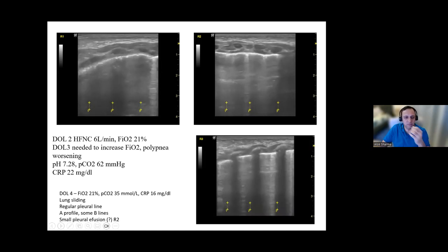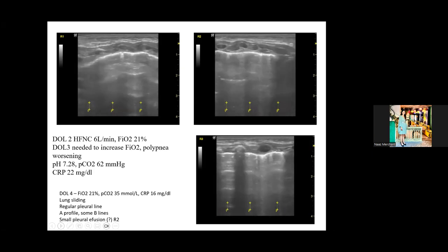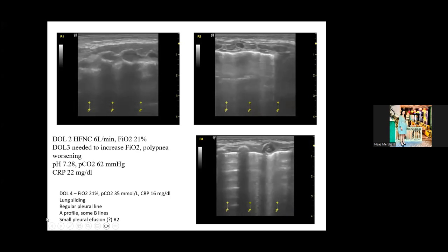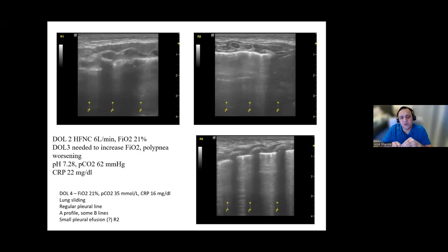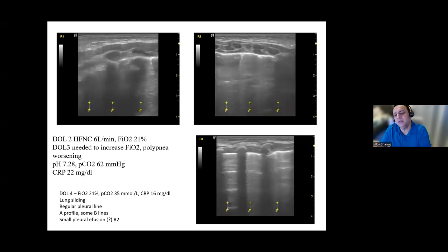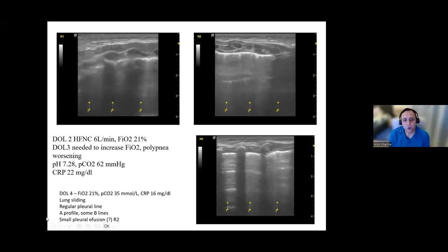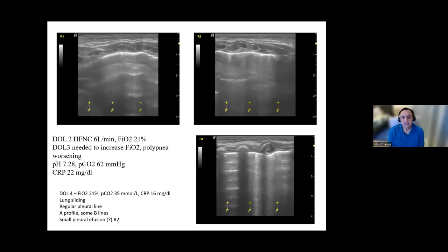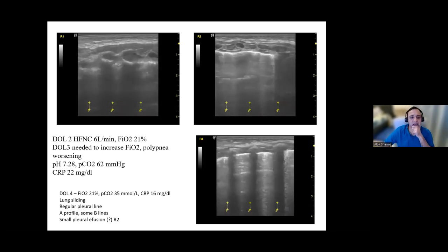So do we think this is meconium? No, because it doesn't have the subpleural, it doesn't have the atelectasis picture. Very good. For the diagnosis of meconium aspiration, you'd expect bilateral lung involvement with predominantly patchy consolidation, evidence of atelectasis, a B profile in the non-consolidated areas with or without a pleural effusion. For me, this is very uniform. It's a course that is quite long. It doesn't give me the definition I need for meconium aspiration.